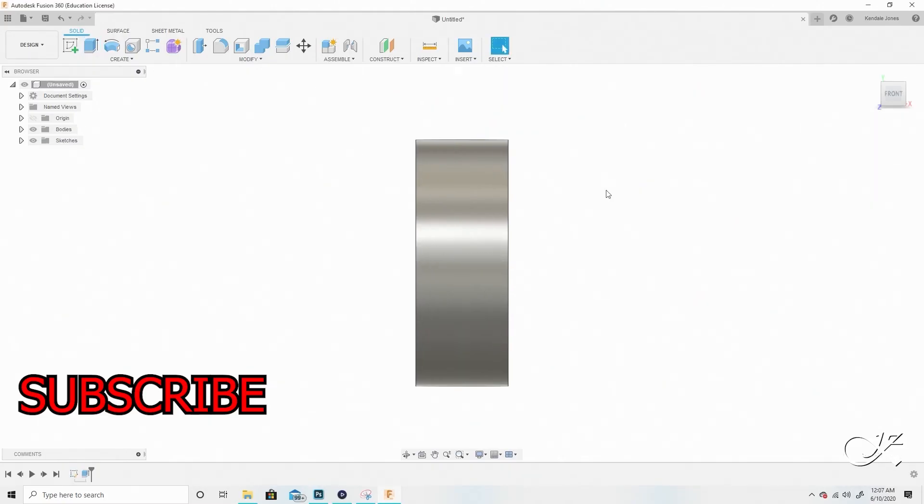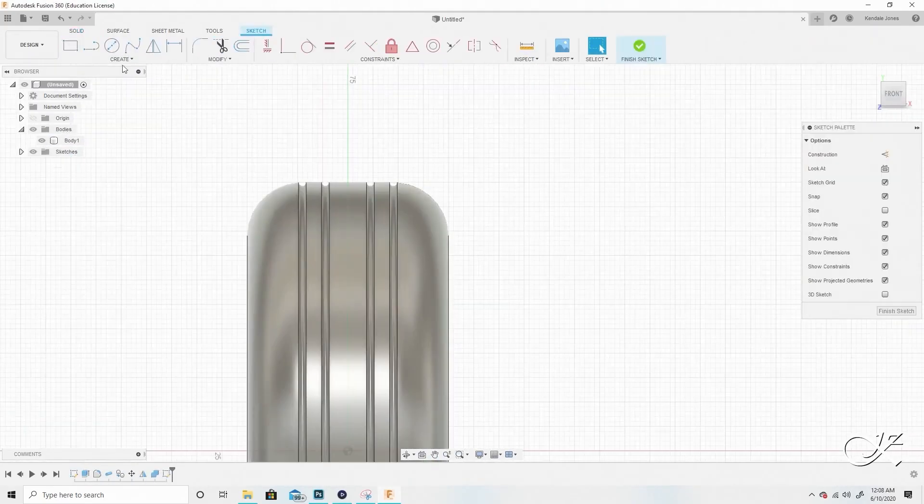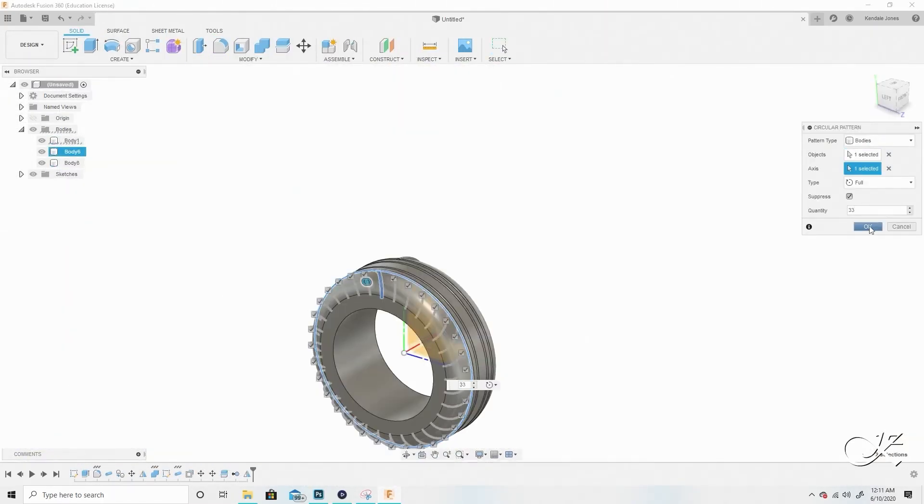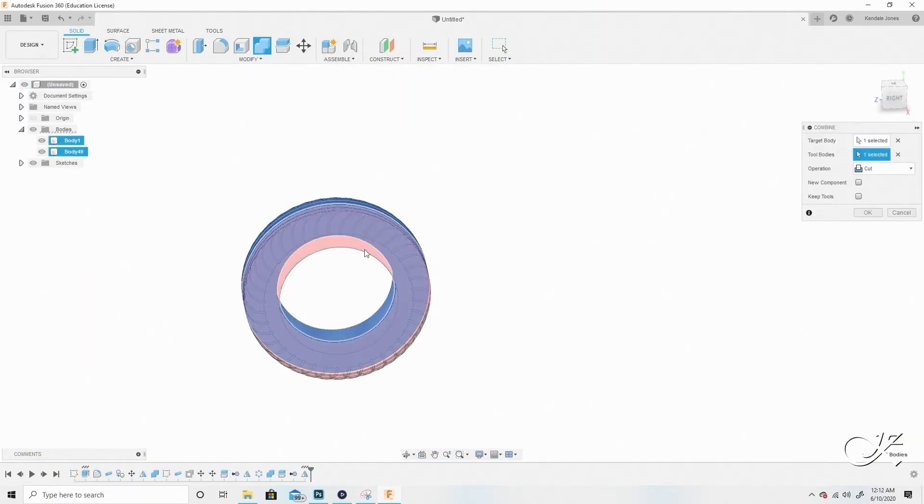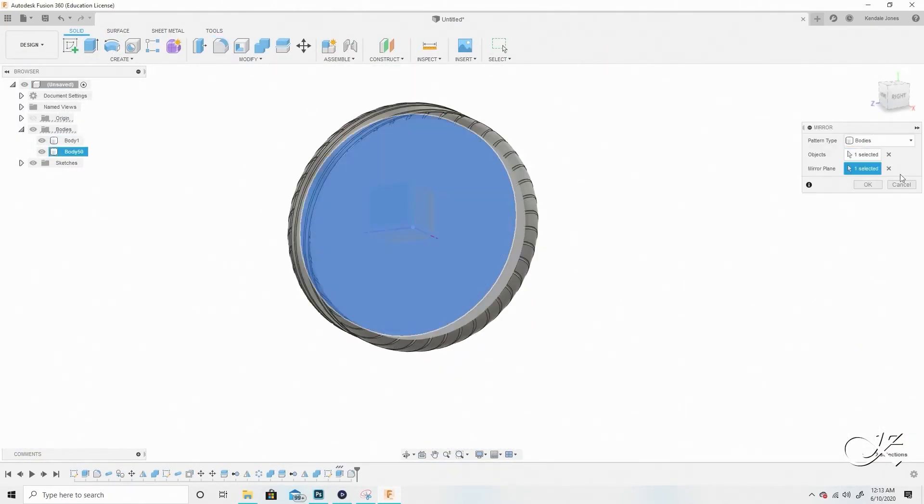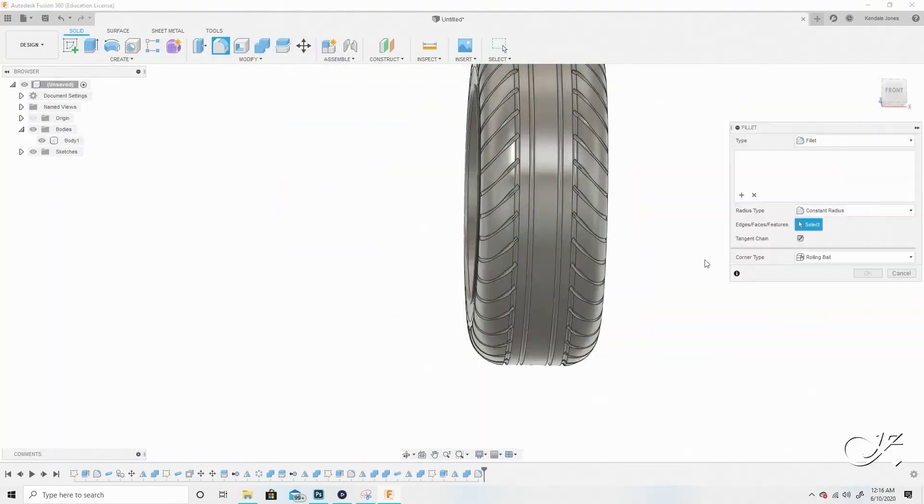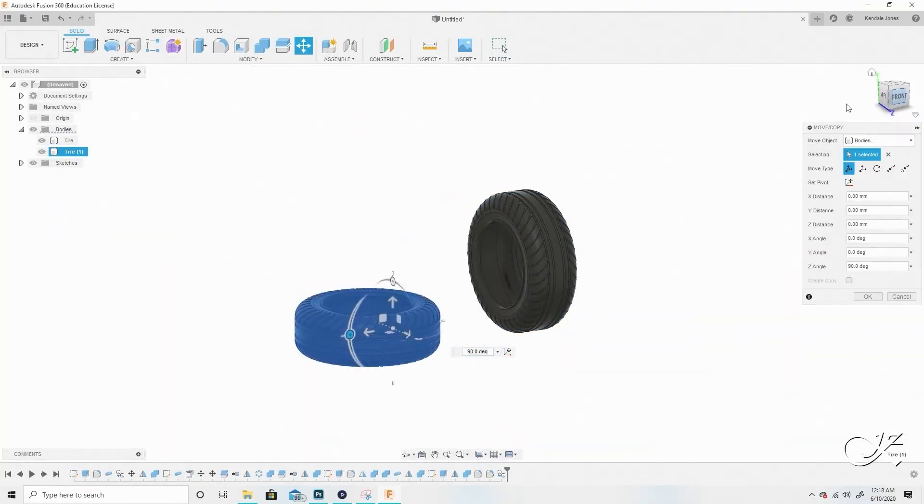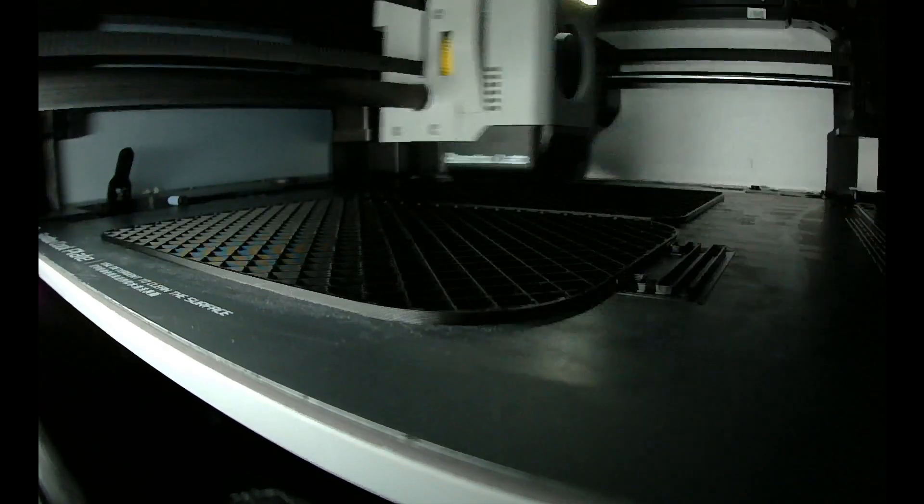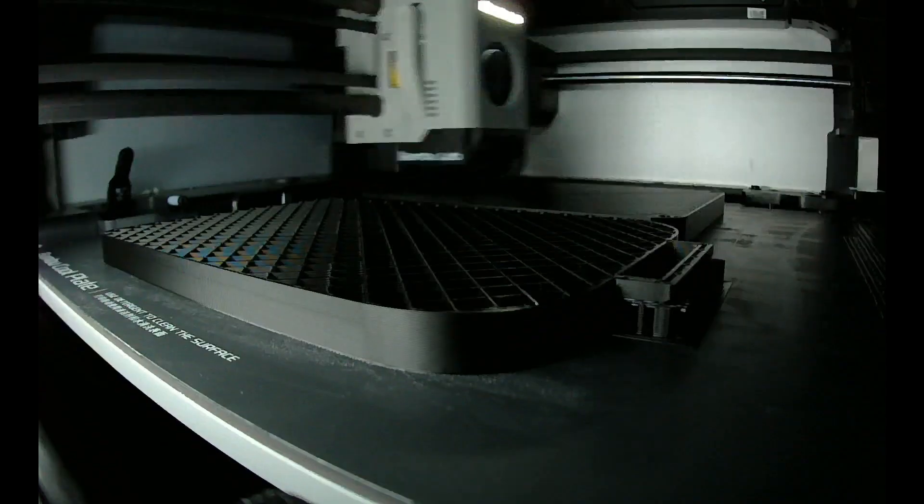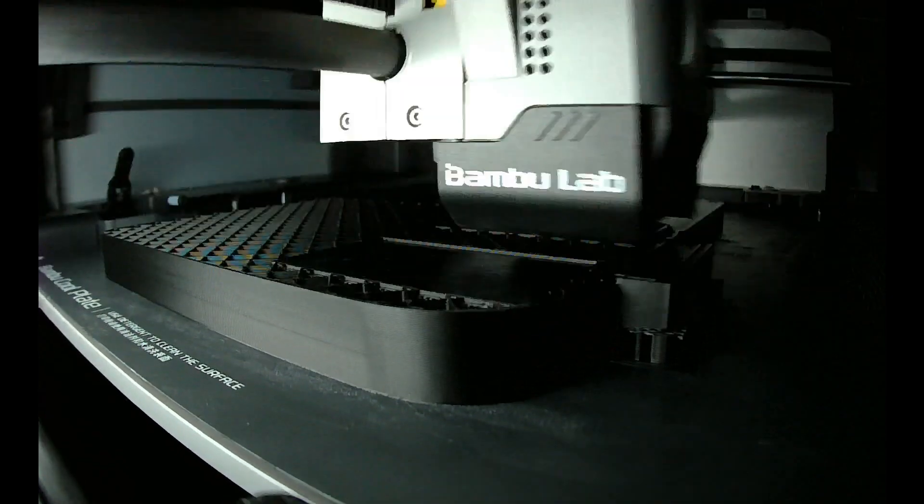After creating the prototype, it was time to model the actual contact lens dispenser. I forgot to record again. Don't blame me, I wasn't expecting to make a video out of it. But I did end up recording some of the printing, so you can enjoy these time lapses.